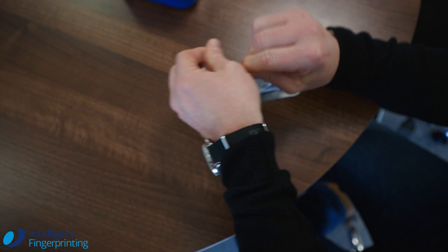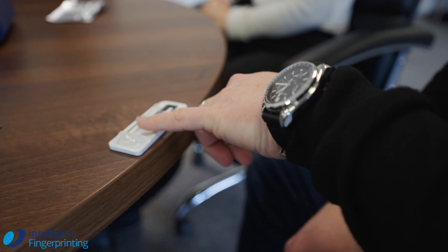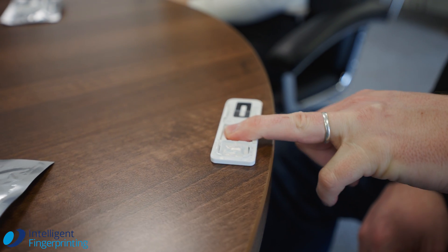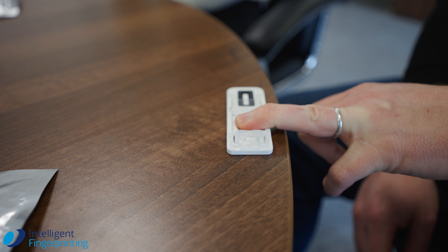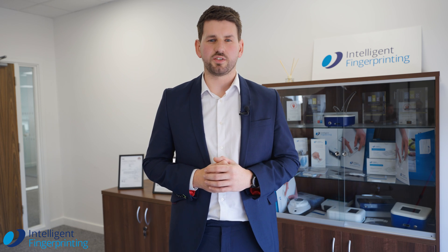Collecting the sample is quick and easy. We're looking for a total of 10 fingerprints onto one cartridge. All we're looking for is to firmly press each digit onto the cartridge, and we'll see a change of colour at the end of the fingernail or redness in the knuckle, which shows enough pressure is being placed and we're leaving a sample behind.